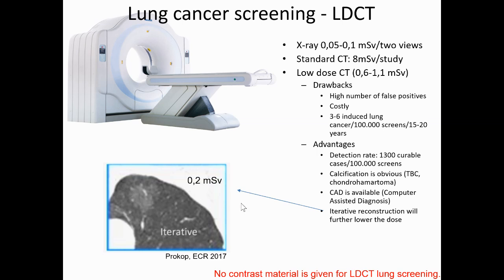So I'm expecting that in about 5 years, X-rays will, well, if not be eliminated, have quite a low number of indications versus CT, because with that amount of radiation, we will be able to perform CT studies.